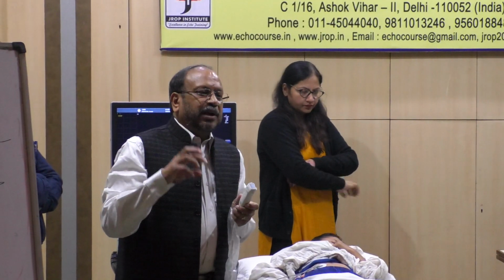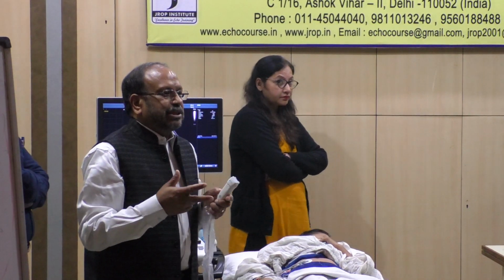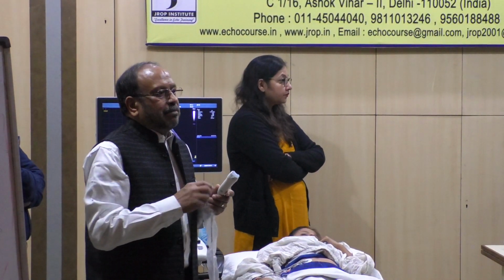So that's how we look at pulmonic veins. We'll look at the mitral and tricuspid valve, and then next comes looking at the ventricular morphology.